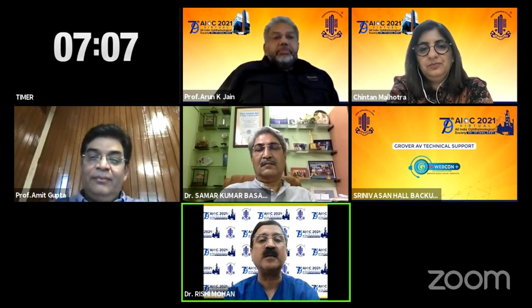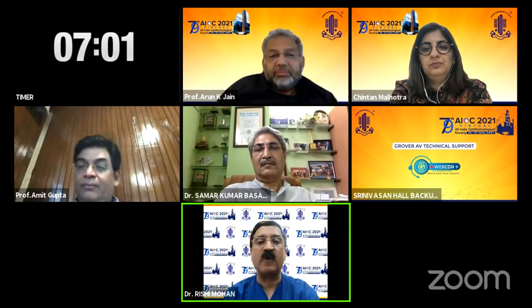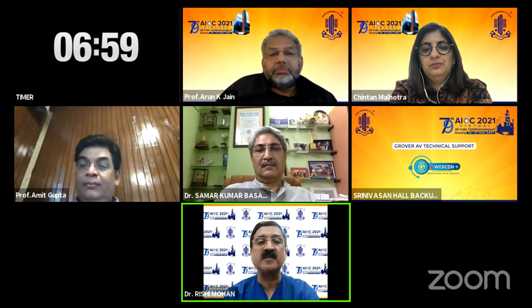That is a kind of a scary number. But the 9s and the 10s or the 8.8s are the ones that bother, because they are the ones which are borderline. With a borderline thickness, with a borderline topography, with a borderline K, with a little bit of posterior elevation, then you know you're dealing with someone who's going to get into trouble. So yes, you have to use this to fill up the blanks rather than to use one value and say, this is going to be the cutoff.